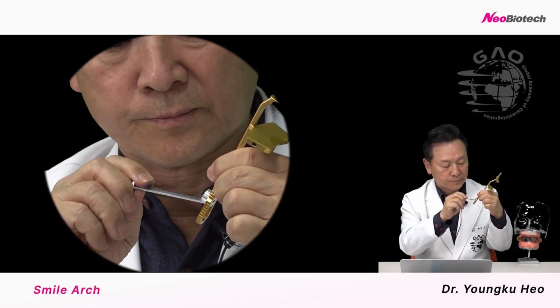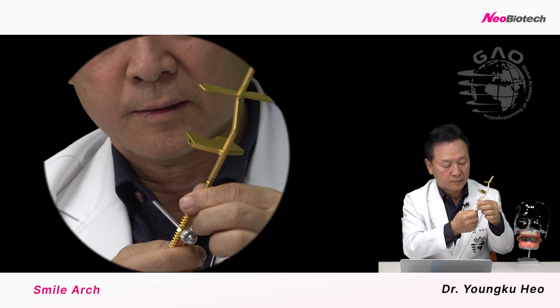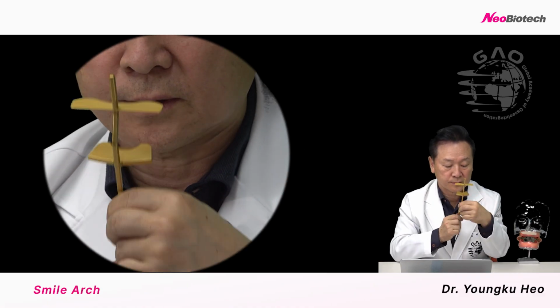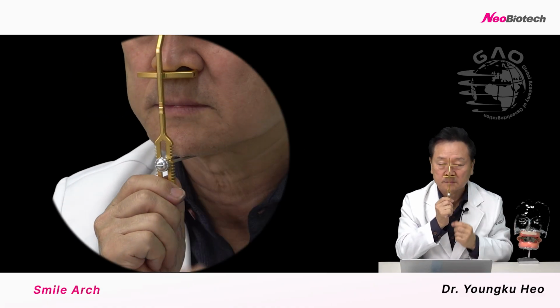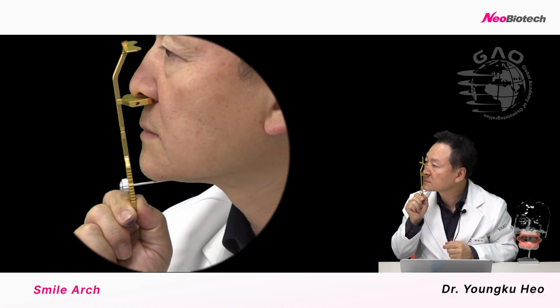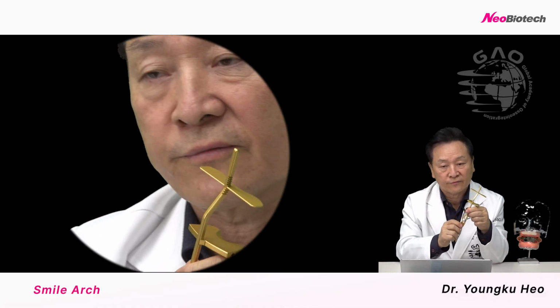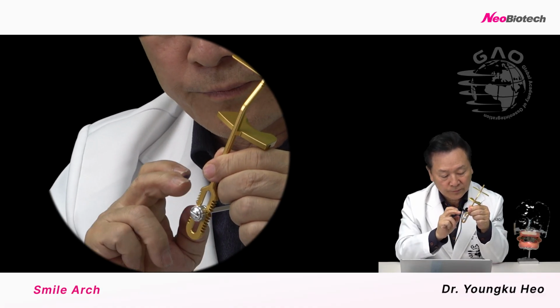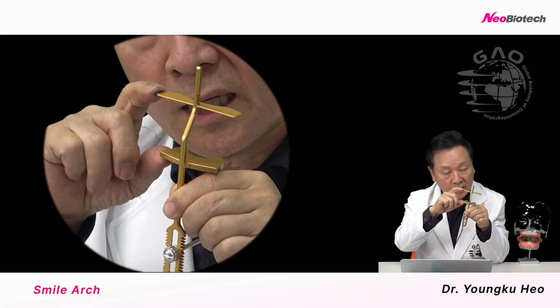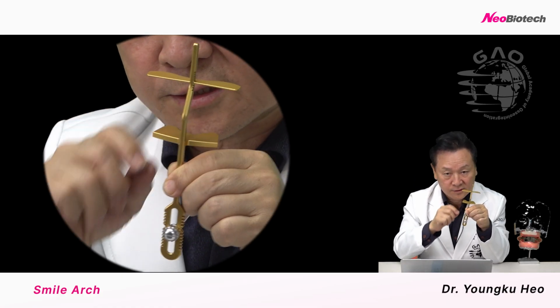This is the D line, which means vertical dimension of occlusion. So like this, we can determine the vertical dimension based on this AP distance.